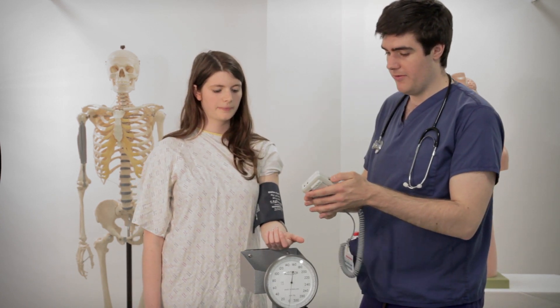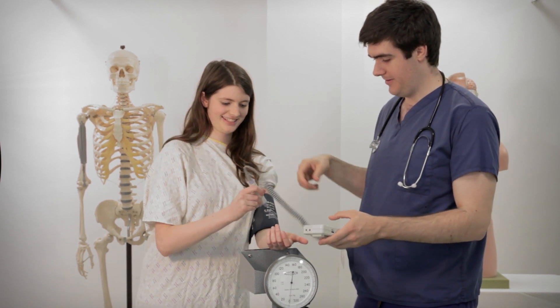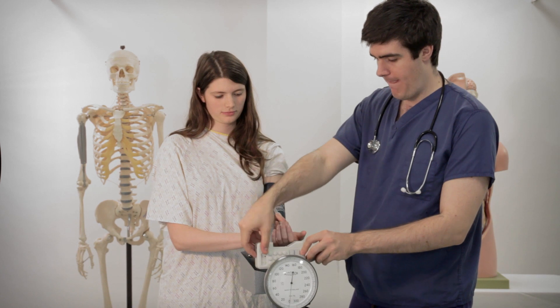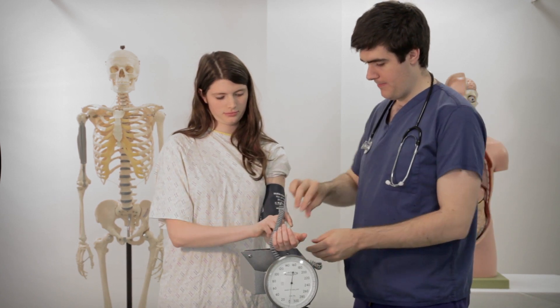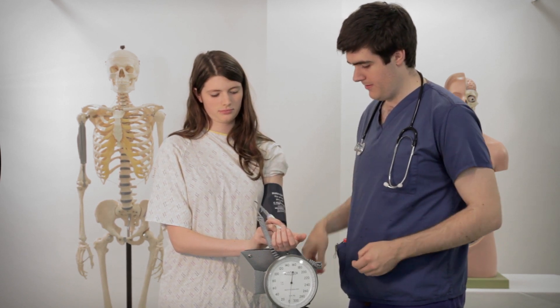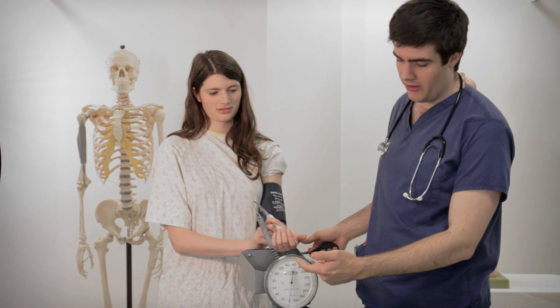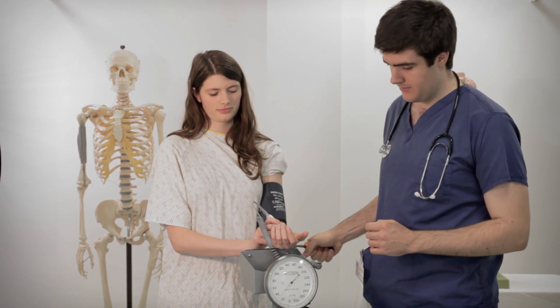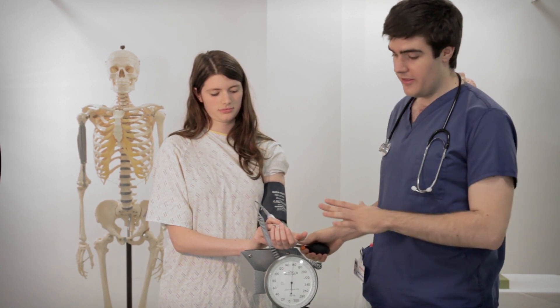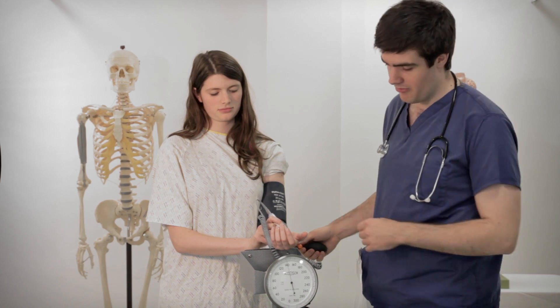So I'm going to ask you Sophie to put the Doppler probe over your radial artery. I need three hands when we're doing this. You'll just get a good sound from that. That's a really nice strong pulse sound. So now I'm going to inflate the cuff until this dial goes up to about 160. And we can hear that there's no more pulse in her arm — all the blood supply has been cut off by inflating air into this cuff. It's much tighter. You can see that the probe's in the same place.